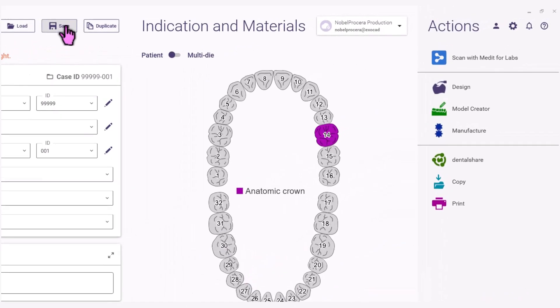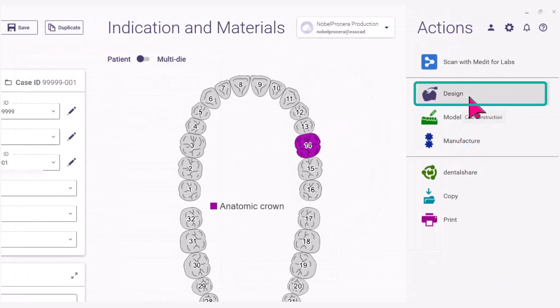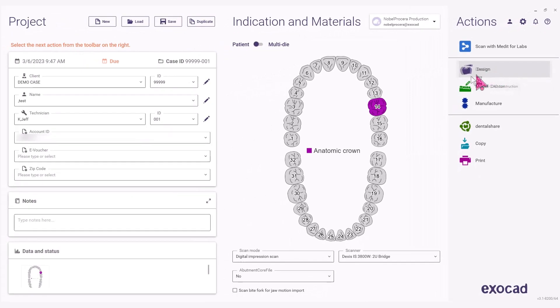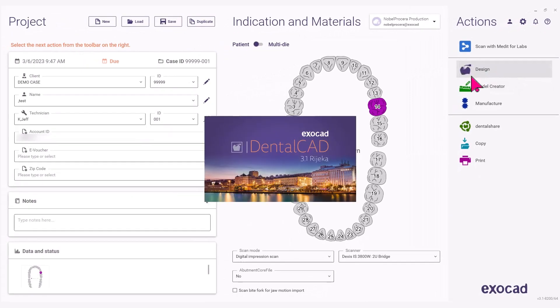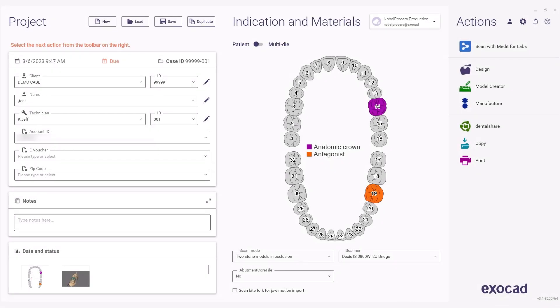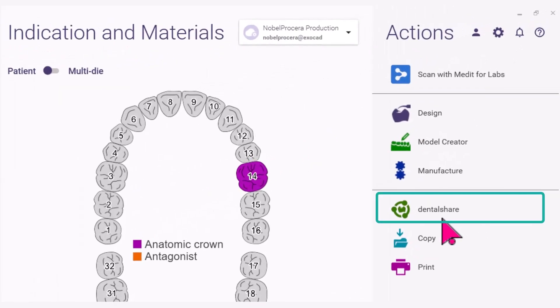Click Save on the top left of the screen. Select Design on the right under Actions to design the case. Once the case is designed and saved, click on Dental Share on the top right.